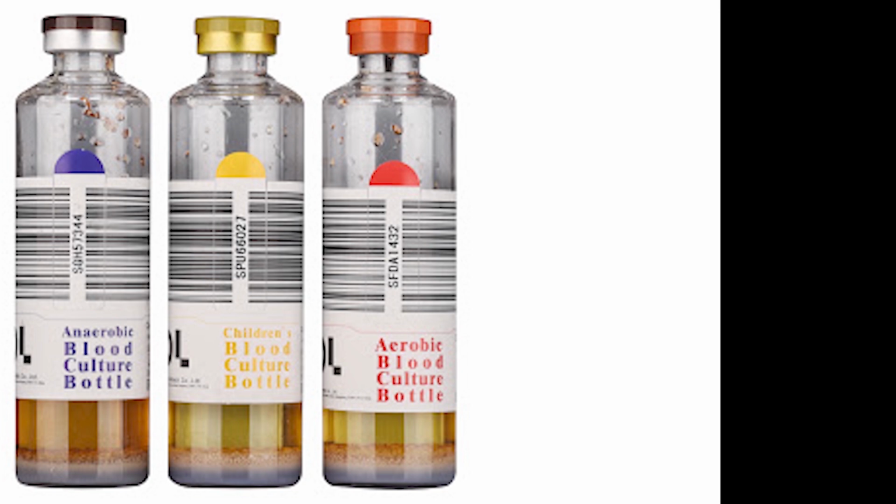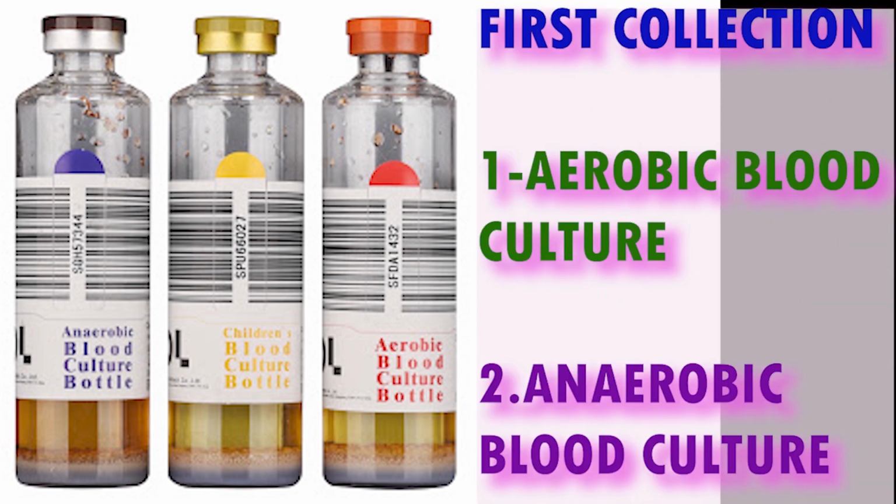Next, we have aerobic and anaerobic cultures. Which is first? The aerobic container sample is first because the air present in the needle and the vacutainer can contaminate anaerobic cultures. So, first is aerobic and then anaerobic.